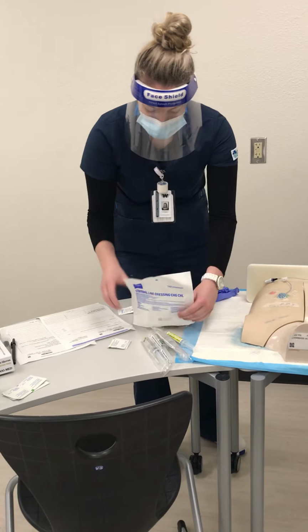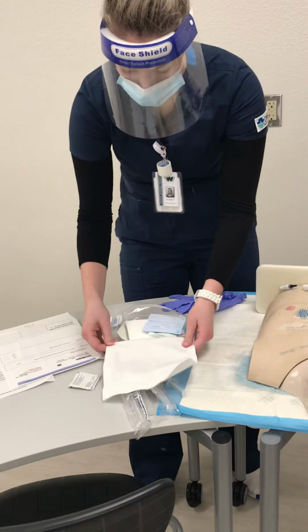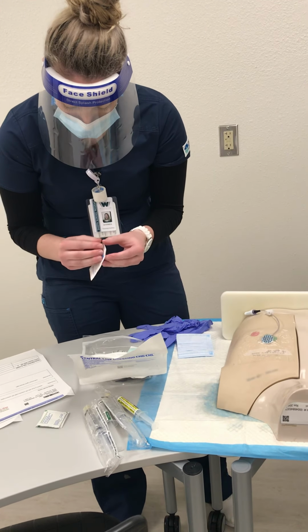So I'm going to need this mask for my patient is why I'm opening it, and I'm also going to add this in there, as it should usually be in there. So we're just going to open this and add it in there so it's ready for when I become sterile.